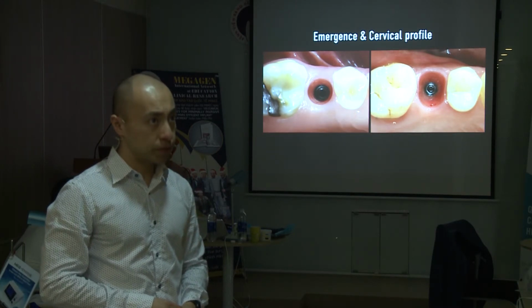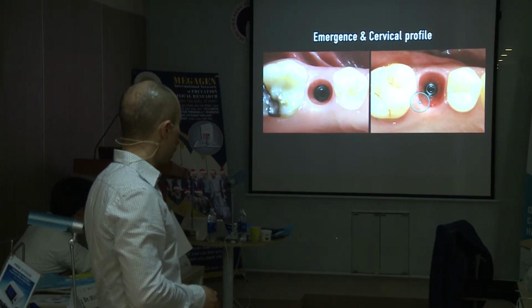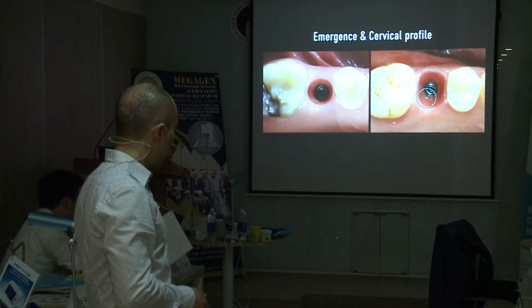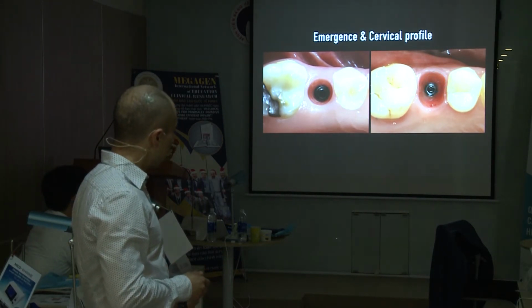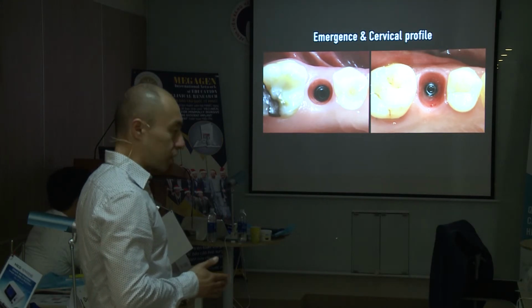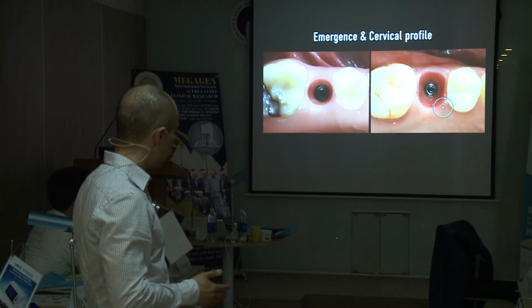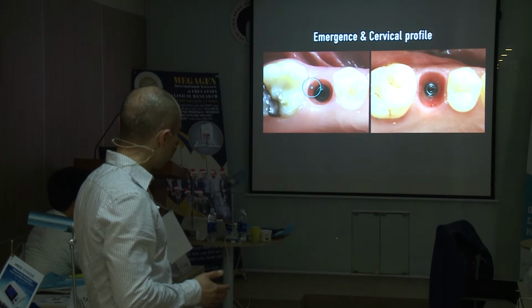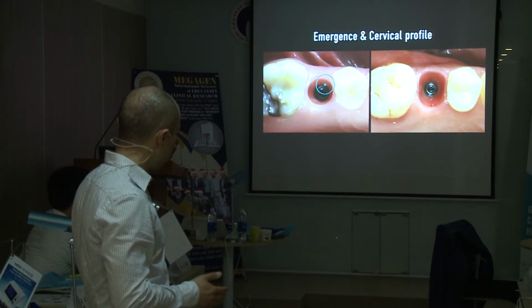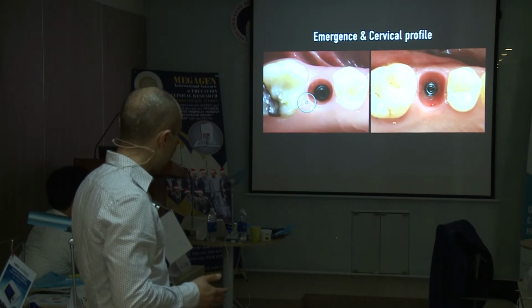And what's the difference? If we make crowns like this, they look very natural, but that's not the most important part. People can only brush their teeth here and here. If we make the crowns come out of the soft tissue from this point, they have to brush this whole part as well, because we get plaque accumulation.